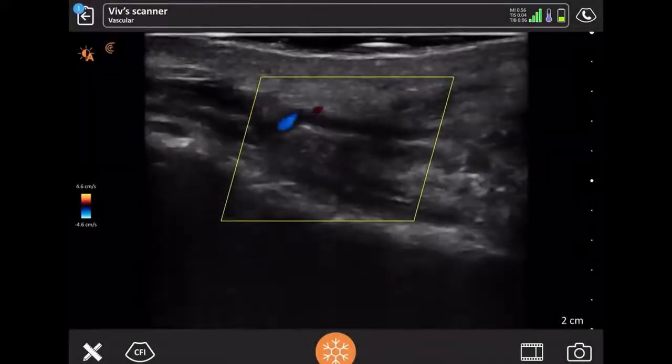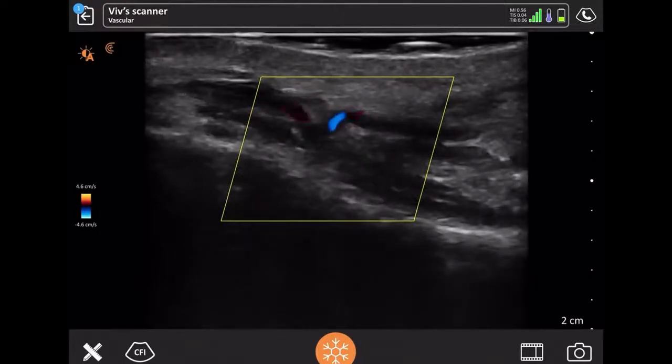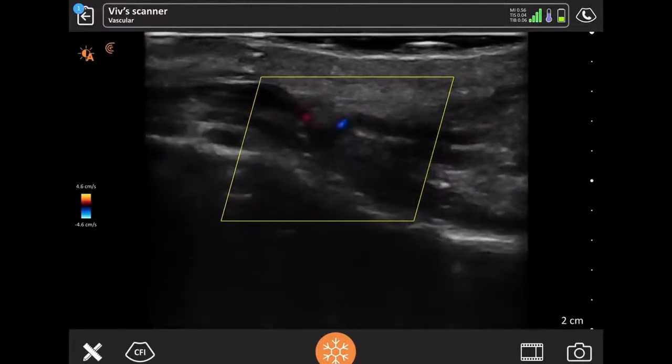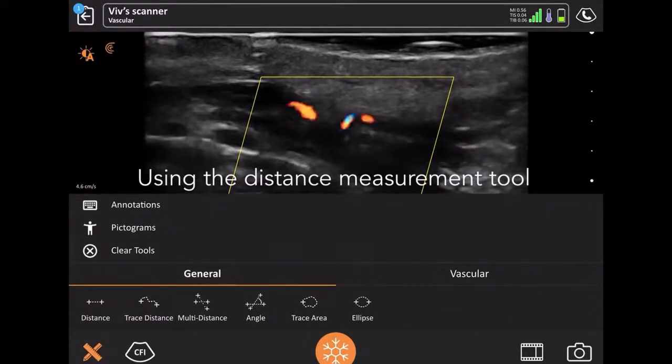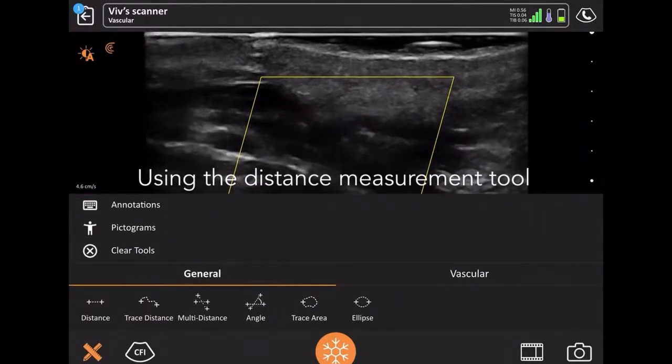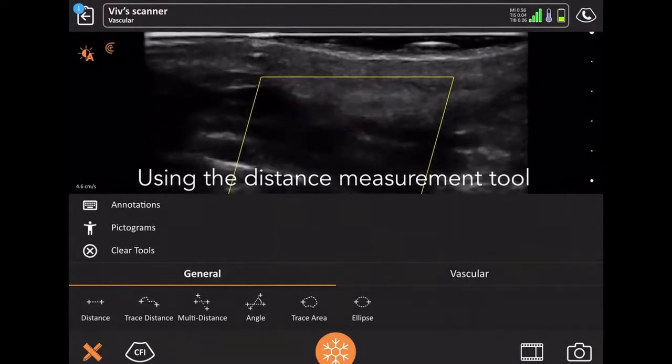One of the things that you can do also is look, not just in one part of the face, you can look anywhere with a scanner, and you can see things like blood flow. You can also look at measurements. You can look at the distance between objects on the scan.